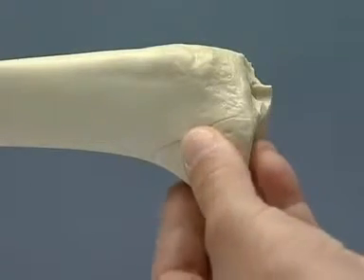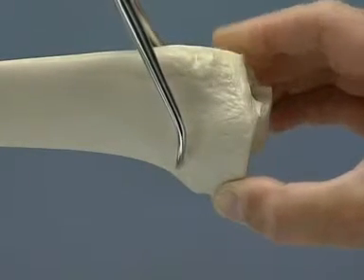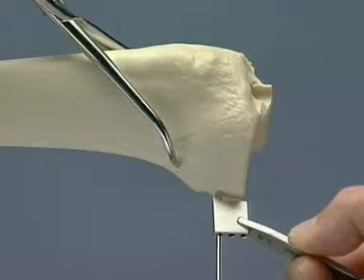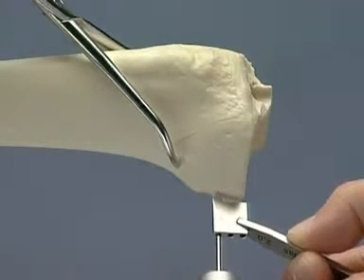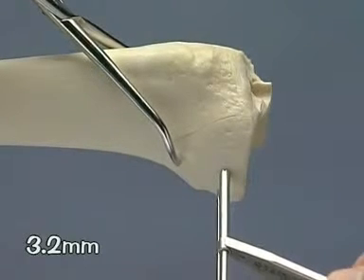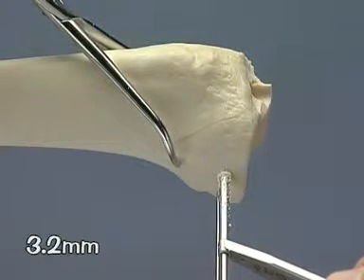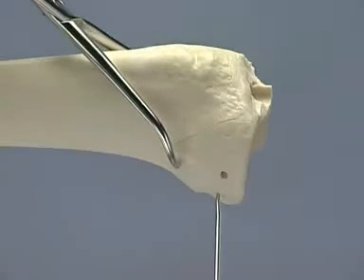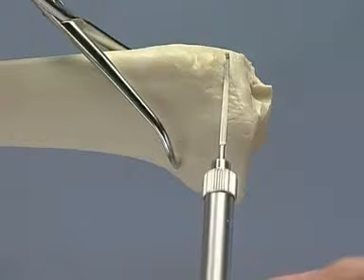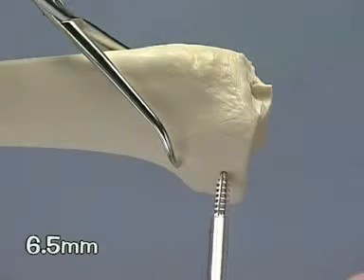Reduce and fix the fragment with a pointed reduction forceps. For preliminary fixation, insert a K-wire parallel to the joint, having previously planned the position of the screw. Drill the thread hole with the 3.2 millimeter drill bit and sleeve without penetrating the opposite cortex. Measure the depth. Tap the near cortex with the 6.5 millimeter tap and sleeve.